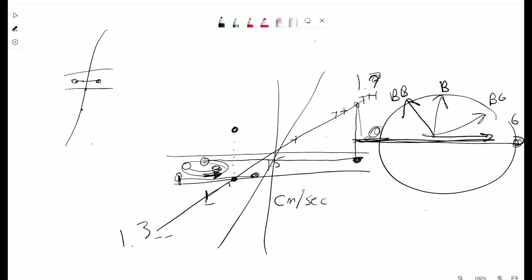And so now you're sensitive to flow going A to P, you're sensitive to flow going right to left, and you're sensitive to flow going head to foot. Put them all together, and you've got yourself bright images where you're not worried about that in-plane saturation that you get on your MRVs. Right.